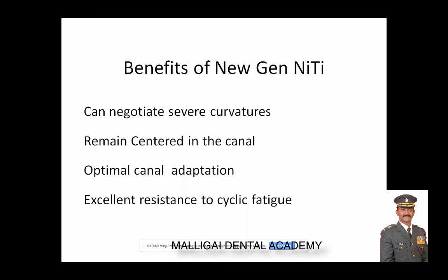So my recommendation is, wherever you are in your rotary endodontic practice, preferably shift to the new generation heat-treated nickel titanium files which have less spring back or controlled shape memory.